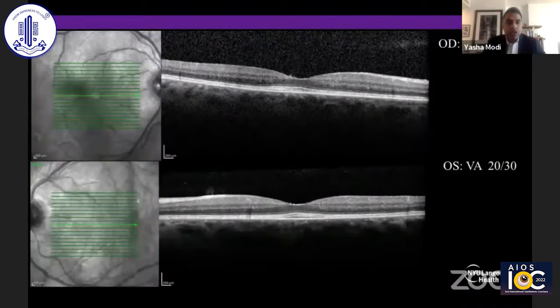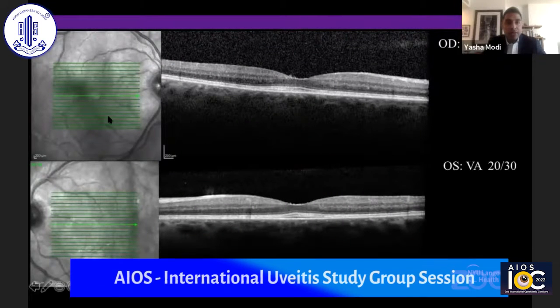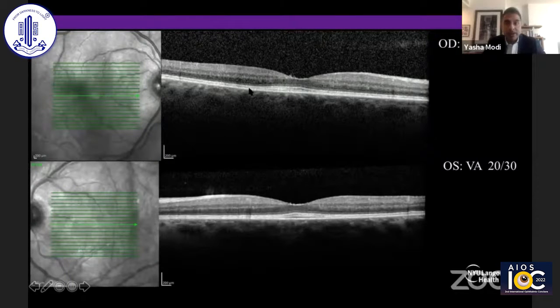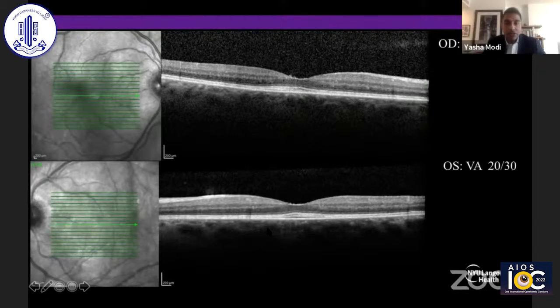When she comes to see us, she has this shadowing appearance on the near infrared reflectance, which almost looks like floaters and corresponds to her vitreitis. And then on the OCT, she has this sort of enlargement or focal thickening of the interdigitation zone. It almost looks like there's a dome elevation where the ellipsoid zone comes up.